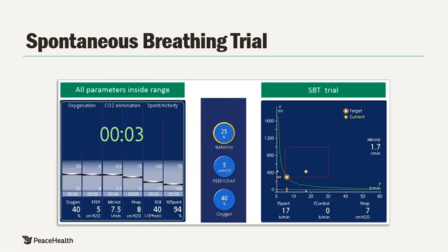Please note, due to the caregiver not needing to adjust modes of ventilation in practice, a patient set at 100% minute volume who meets all 6 criteria can successfully begin weaning with no effort on the part of the caregiver. Remember, ASV is one mode for the entire course of ventilation.